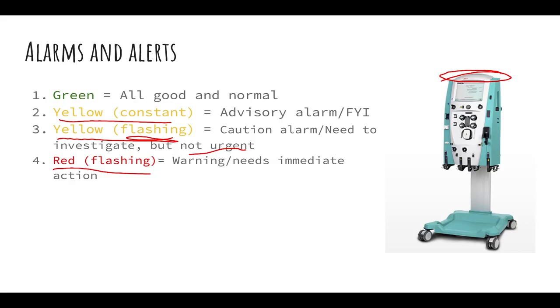So this is more of a general need-to-know before you run a CRRT device. Like I said, it's not everything.